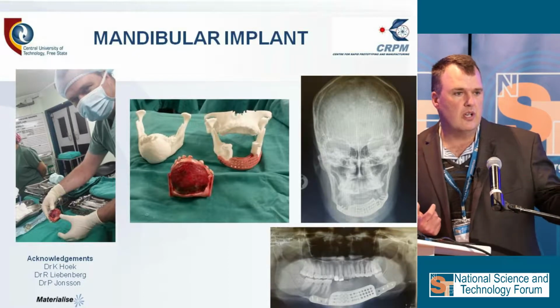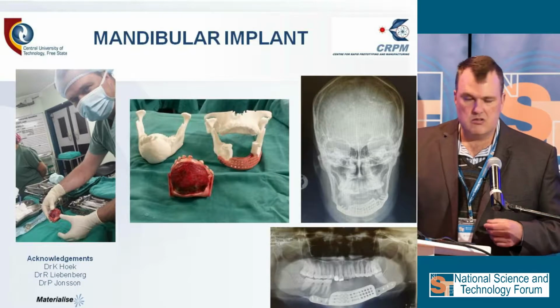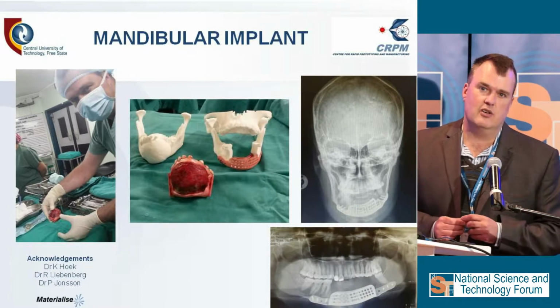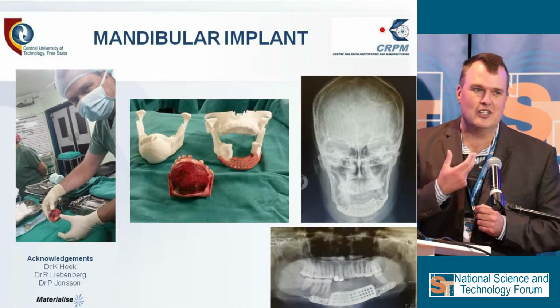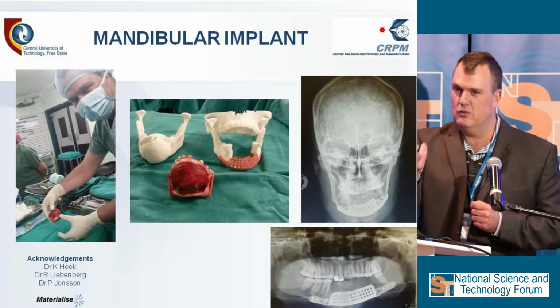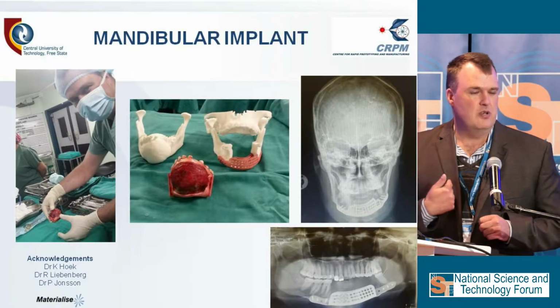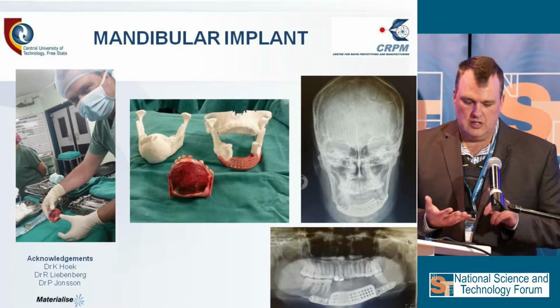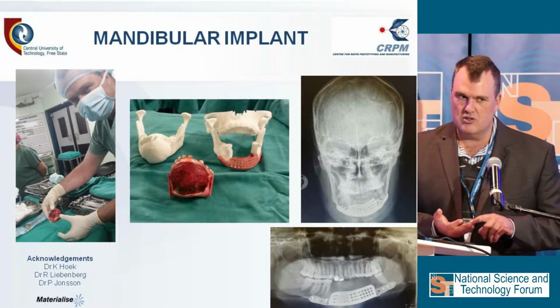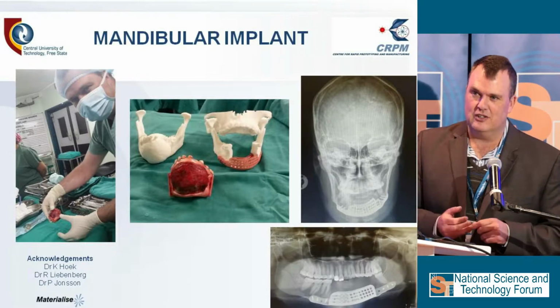So again, I was talking about this reduced theater time. If we use this and you get it right, it's really not so easy. People are saying, just design a cutting guide, but you must think of where the tumor is growing to, which perimeter you are using. If we see a CT scan, remember, it's stripped from all the nerves, all the arteries, all the soft tissue, it's just the bone. So how do you design that to actually fit?